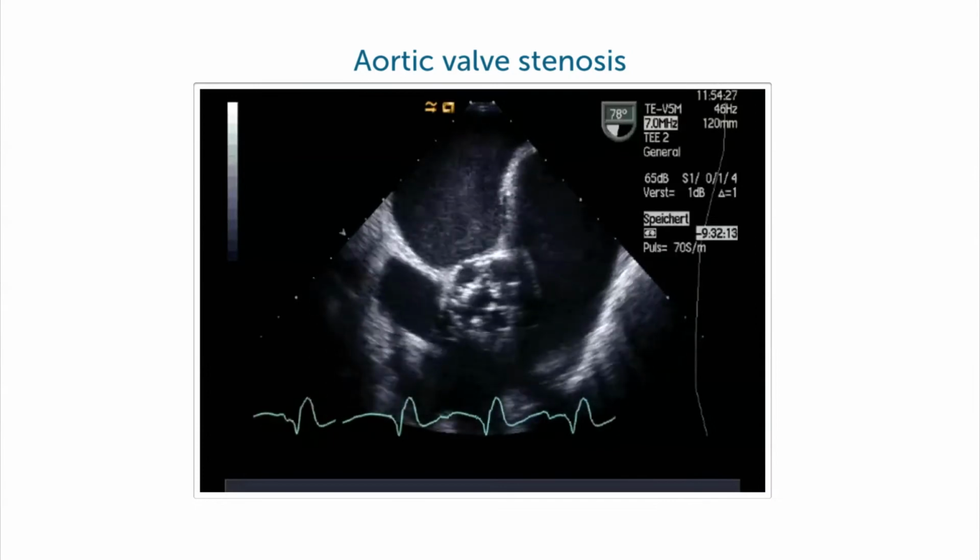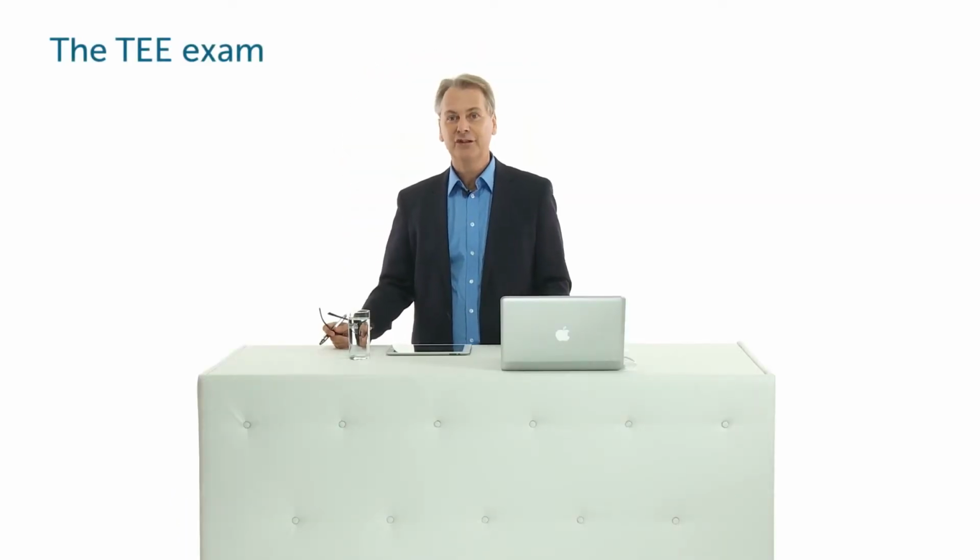And with TE, we're able to look at the morphology of the valve, and if we use Doppler, also assess the severity. Are you ready for your first transesophageal echo? Before we start, you need to know how to prepare the patient.